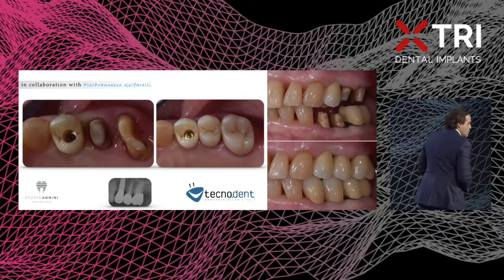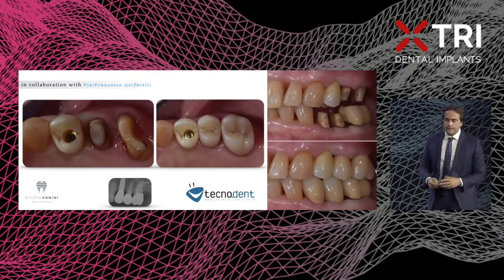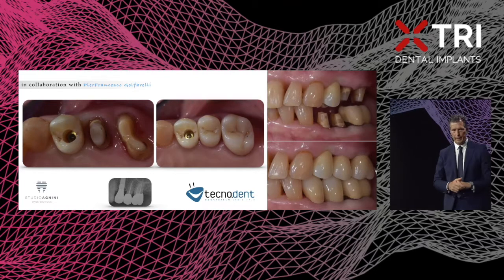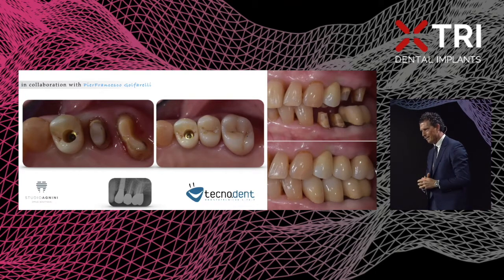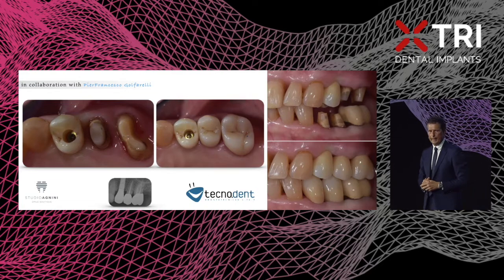On one side, completed in the upper and lower, because also in the lower there were 2 teeth abutment that were done. So the periodontitis has been treated, and we put in correct position the implant, the tissue level matrix implant, and then we finalize the case.